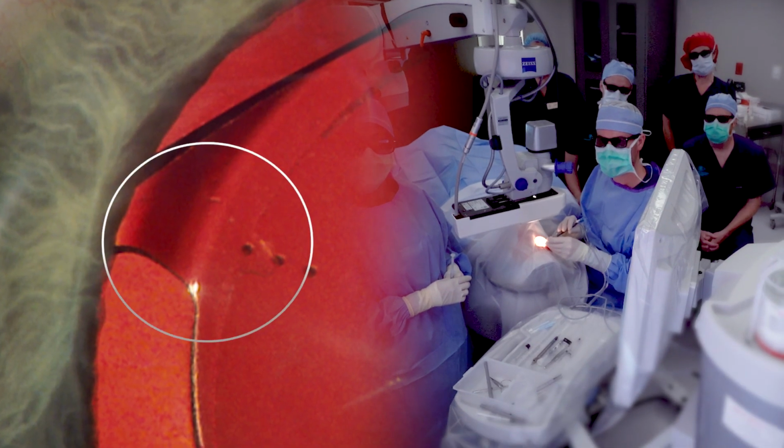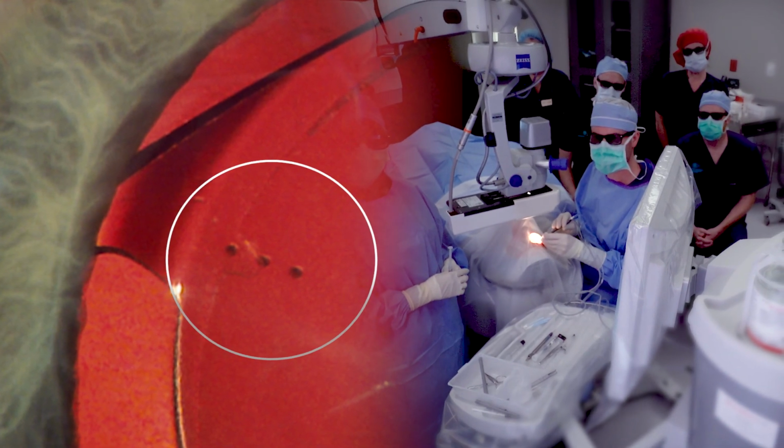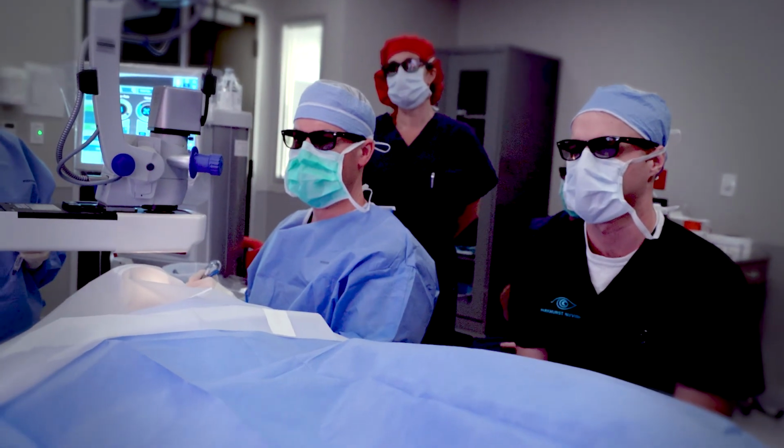And then what the LENSAR does in the case of a toric placement is it makes these little nubs, or I think they call them IntelliAxis L marks, or whatever you call them. I call them nubs. But there are these little marks in the capsule that show me where to put my toric. I do use intraoperative aberrometry.